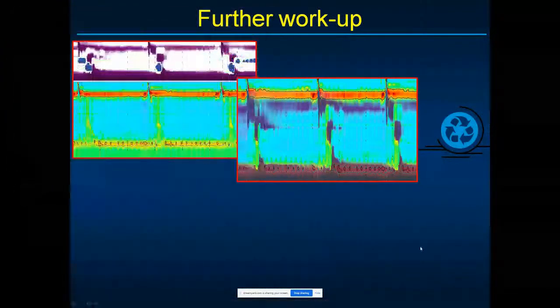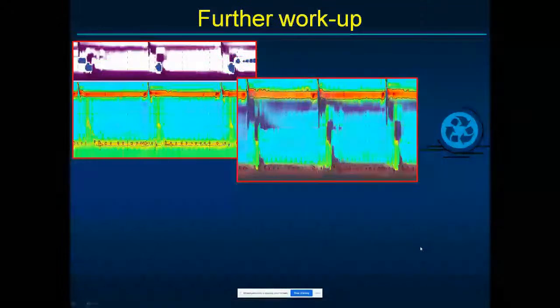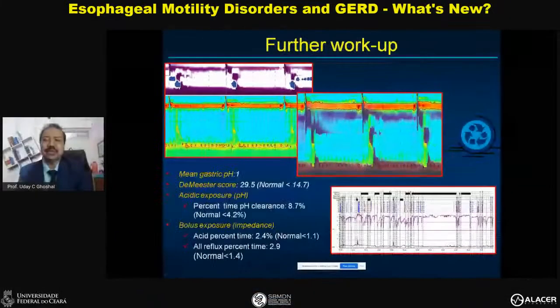So we thought he may be having reflux, so we did pH metry and it was grossly abnormal. So what was happening is he may be having an esophageal muscle disease, something like a scleroderma physiology. He has a low LES pressure, but it is relaxing very well because he has hardly any muscular activity. The manometry done earlier misinterpreted this movement of the catheter as simultaneous contraction activity and led to an erroneous diagnosis of achalasia cardia, and he was going to undergo a POEM.